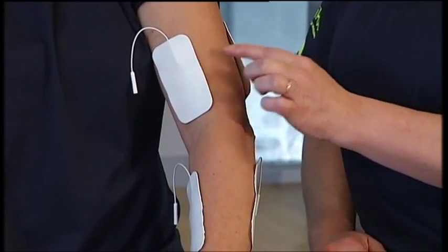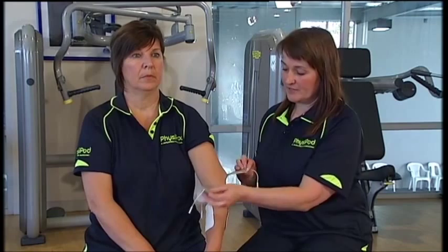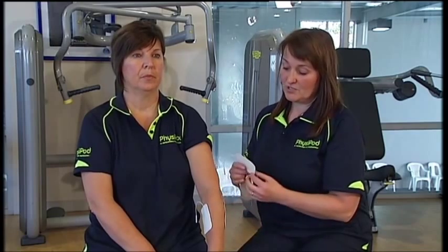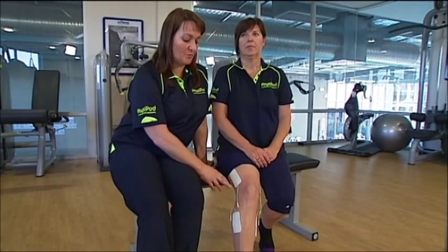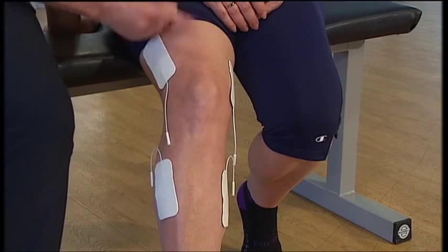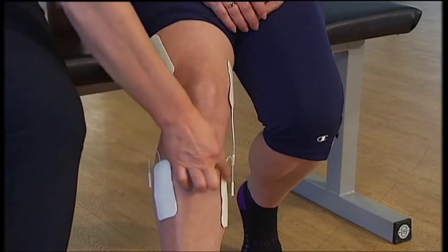For elbow pain, post-operative elbow trouble, or tennis elbow, place two electrodes either side of the elbow above the joint line and two below. Alternatively, for tennis elbow you could just use the two above the joint. You can also use a smaller electrode size on smaller areas like the elbow. For knee problems — knee swelling, knee pain, medial ligament strain, or anything muscle, tendon, or ligamentous — TENS and EMS will help. Place electrodes either side of the knee joint above it and either side below.